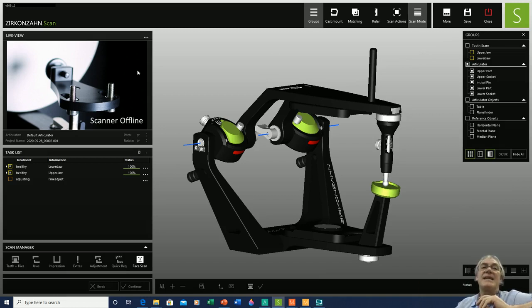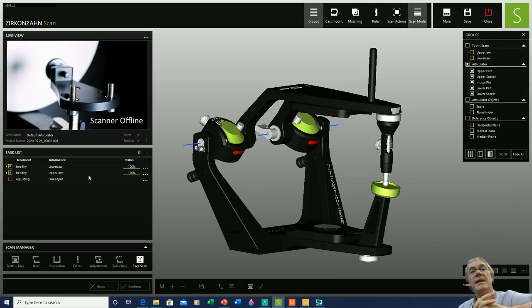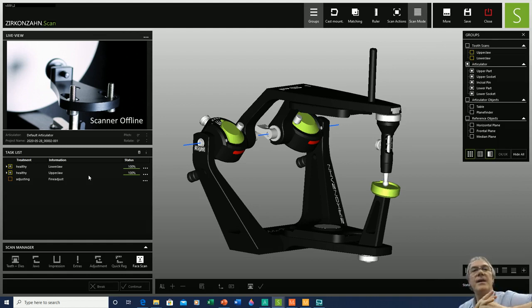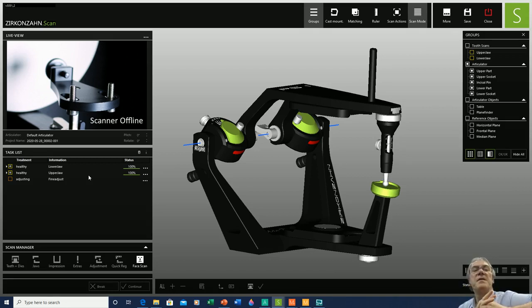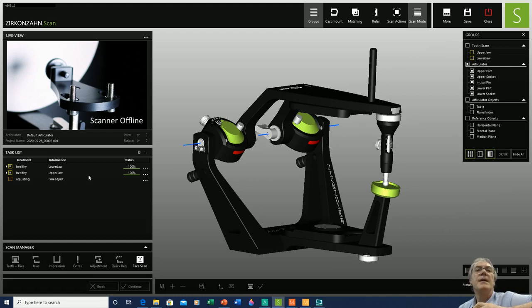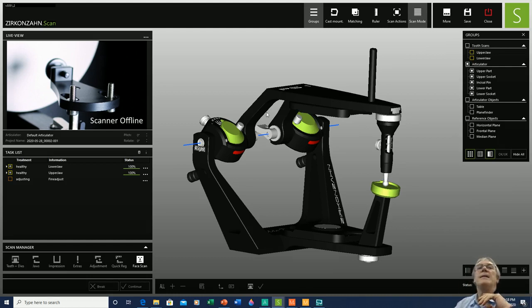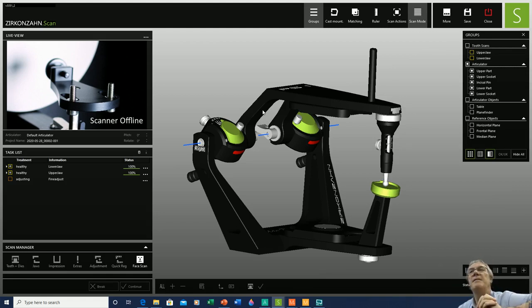Our scan mode relates to the task list, which is created through the archive. When selecting the actual project, we selected two models as healthy, and in order to perform the functional evaluations, we have not included any type of therapy at the moment.